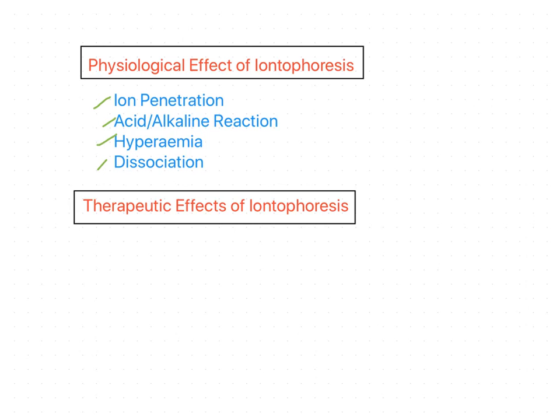The ion penetration is generally less than 1 millimeter, with subsequent absorption to deeper tissues via capillary circulation and transmembrane transport. The depth of drug delivery with iontophoresis, though uncertain, has been demonstrated in certain studies to reach a depth of 3 millimeters to 20 millimeters.